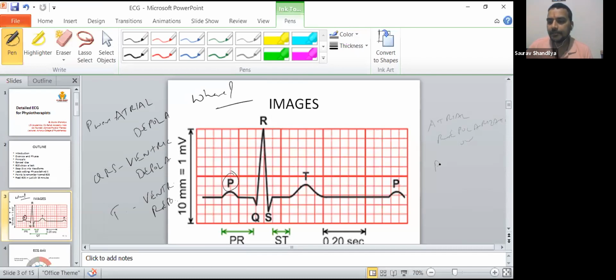So it is a pathological feature rather than any physiological feature, right? That's what I want you to learn about it. Atrial repolarization happens, my friend, but it doesn't show up on the normal ECG paper. But it happens, right? If you don't have a good QRS wave, then definitely you will find it. Well, okay, fine. This was the one theory I wanted you to understand, atrial repolarization.